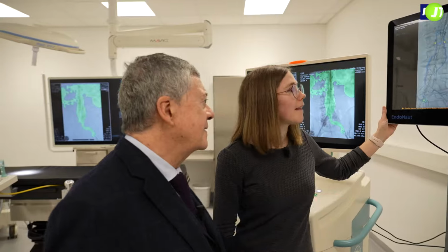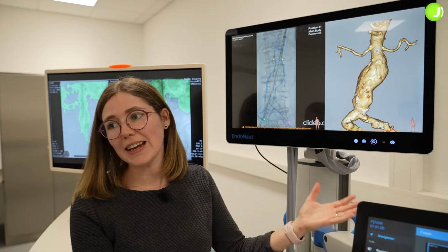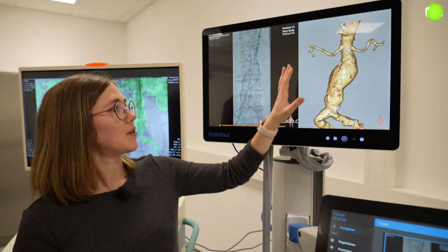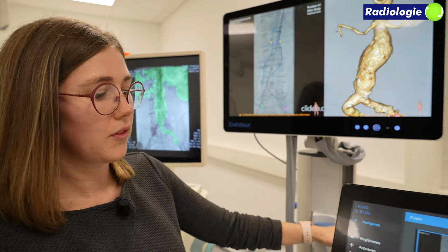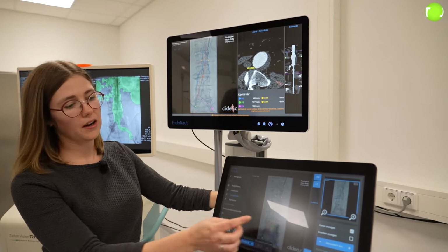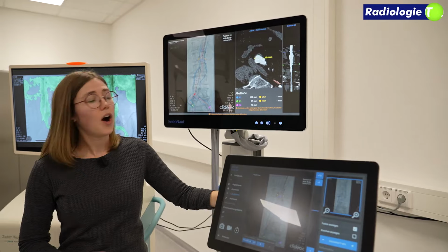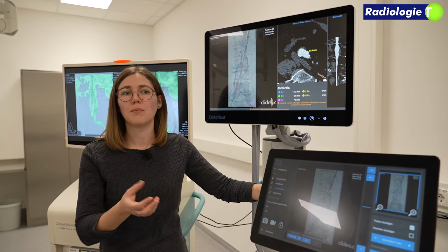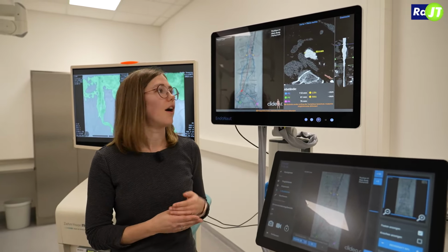And on the right side of the screen, that's the 3D rendering coming from the CT data. So you always have available in 3D all the information from the CT. You can have a look at the anatomy of the patient again. You also have the opportunity to see the CT slices. We can go through all the slices, look at each slice of the CT again, or do intraoperative measurements to make sure you have the right stent length, or that the strategy during your procedure is like you planned it before.